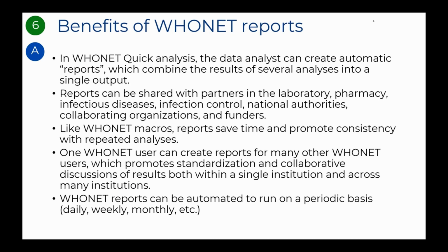One WHONET user can create reports for many other WHONET users, which promotes standardization and collaborative discussion of results, both within a single institution and across many institutions. WHONET reports can also be automated to run on a periodic basis, for example, daily, weekly, or monthly.